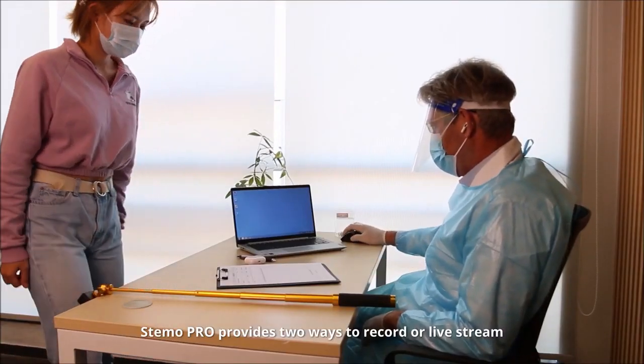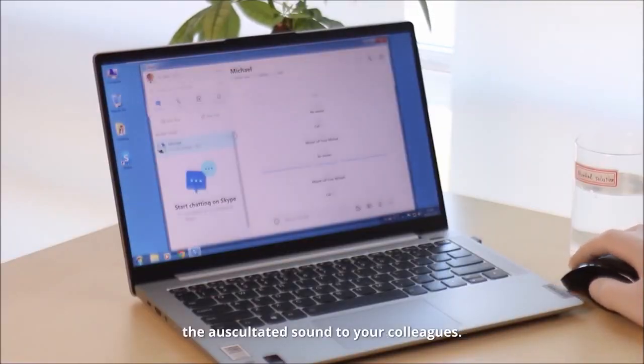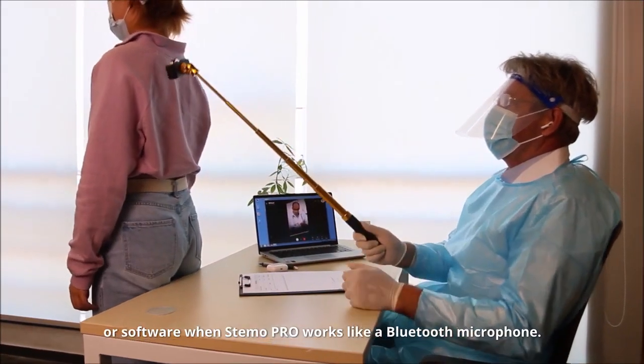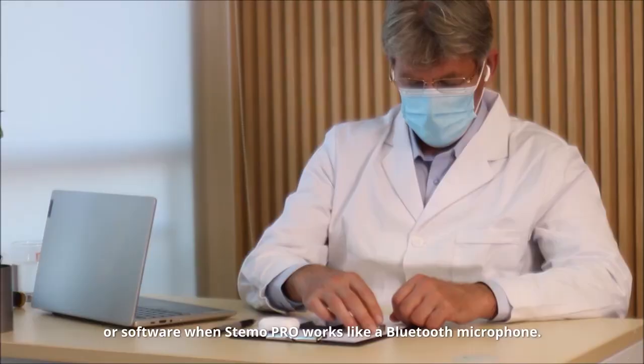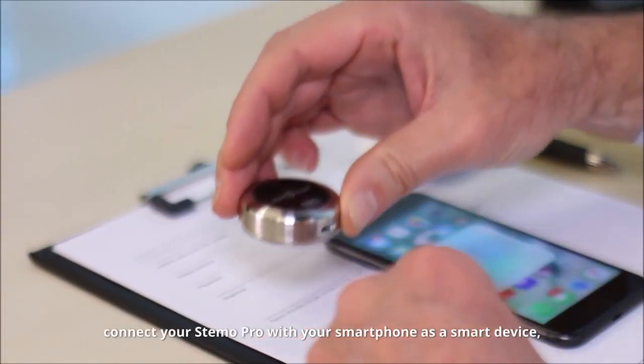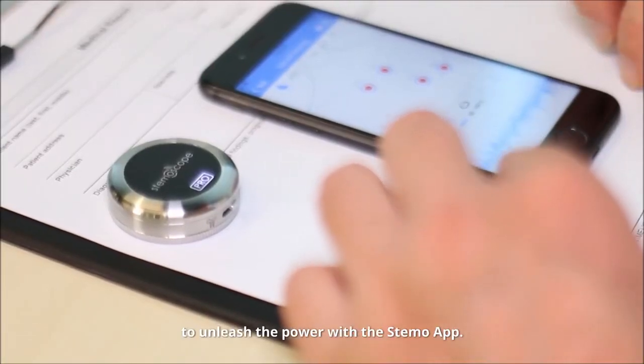Stemo Pro provides two ways to record or live stream the auscultated sound to your colleagues. One way is to use general voice apps or software when Stemo Pro works like a Bluetooth microphone. Another way is by sliding the switch to the right, connecting your Stemo Pro with your smartphone as a smart device to unleash the power of the Stemo app.